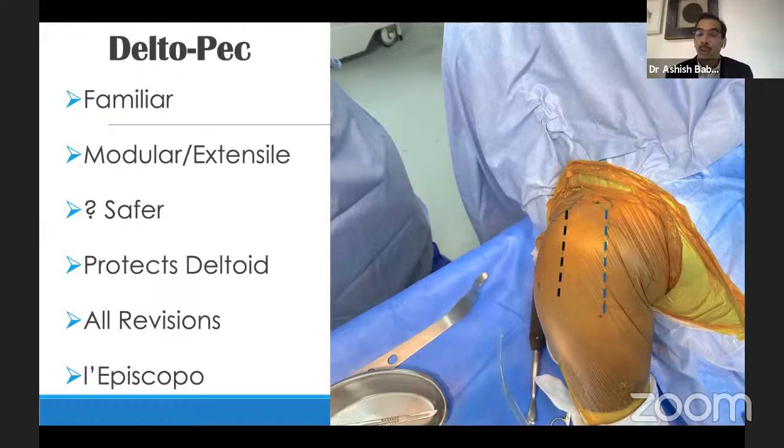If you see some of your proximal humerus fracture cases or the deltopectoral cases, 6 months down the line, they're sloughing off of the anterior deltoid. And that's probably because the anterior branch of the axillary nerve has been damaged because of that anterior bone lever. So you must be very careful where you put your Hohmann in. It's not necessary that the deltoid is always protected.